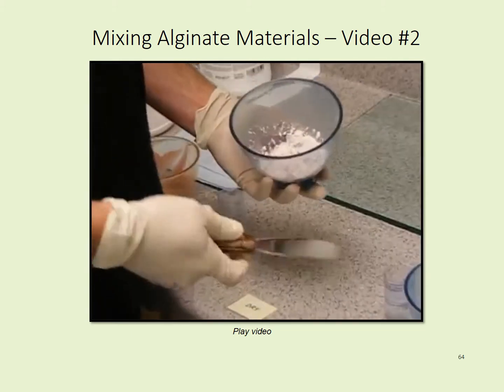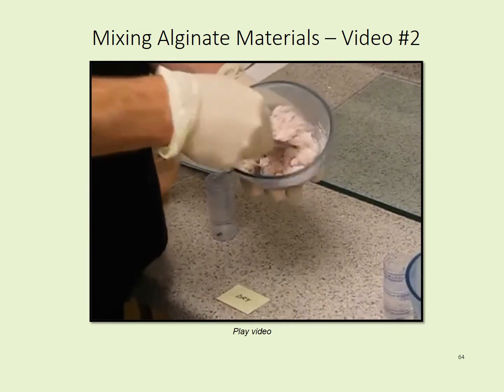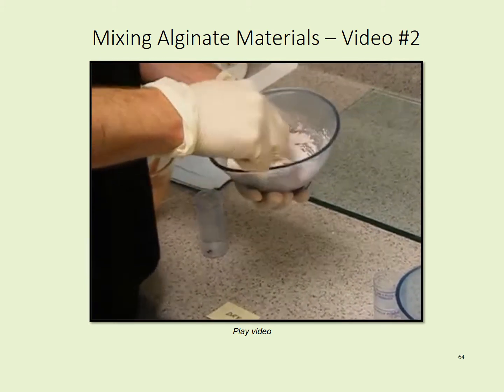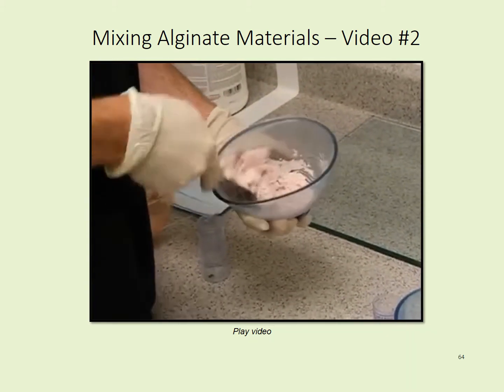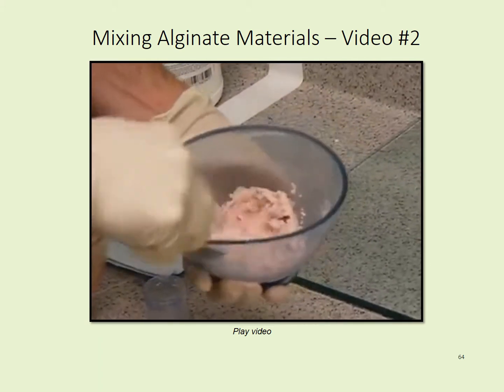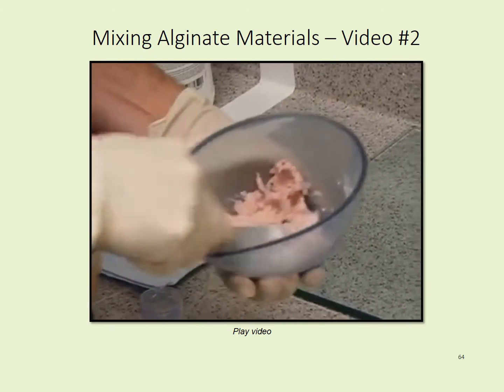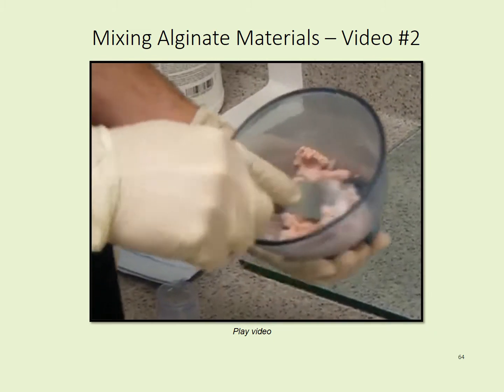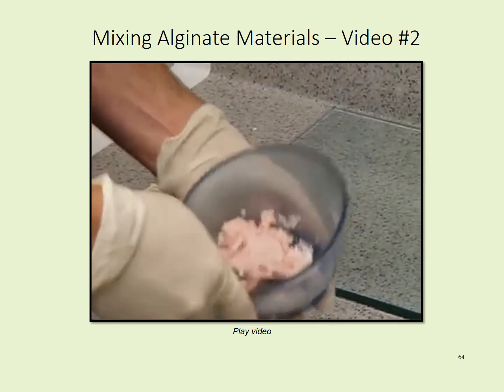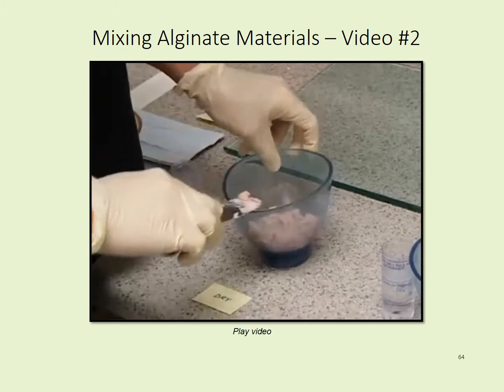The dry mix, however, is the opposite from the wet in that it takes quite a long time for it to look like the material is being thoroughly wet. And so as you continue to stir any of the moisture into the mix, you will see that it has a very powdery look to it and a very chunky look to it, and it will not go smooth at all. Dry spots are often left at the bottom of the bowl, as you can see there, and it's very crumbly when you pick the alginate up.